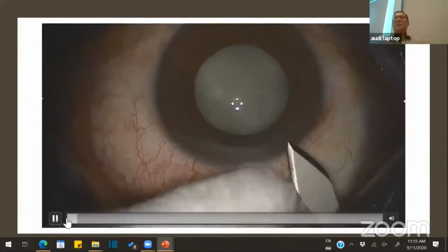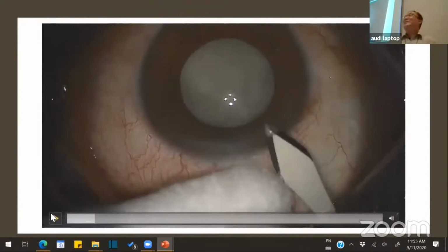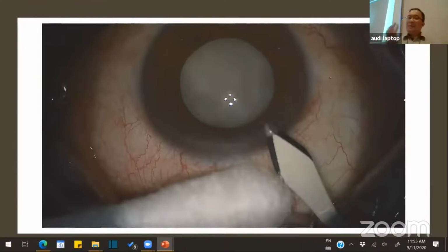Okay. When you are so anxious, right? So anxious, you're nervous, you're doing it, you actually tend to press. It's actually the same thing when your trainer said you're actually pushing the eyeball down, right? It's because you're pressing your Phaco probe onto the wound and do your Phaco. That's why it's rotated down.